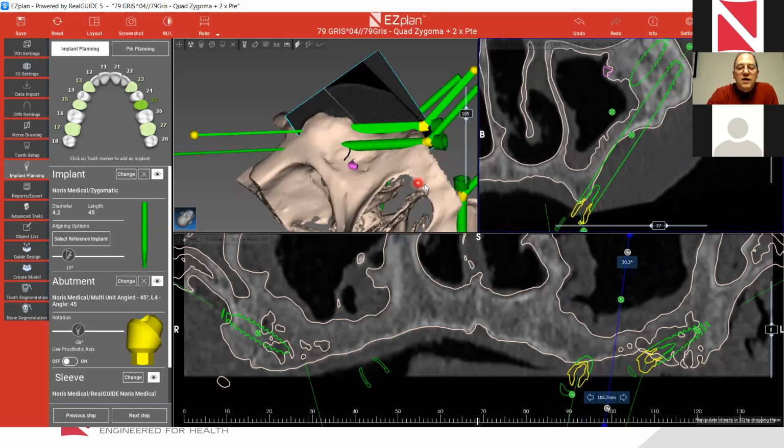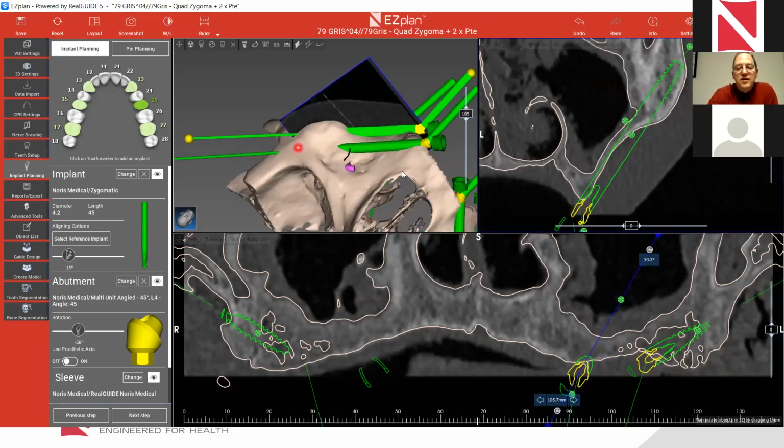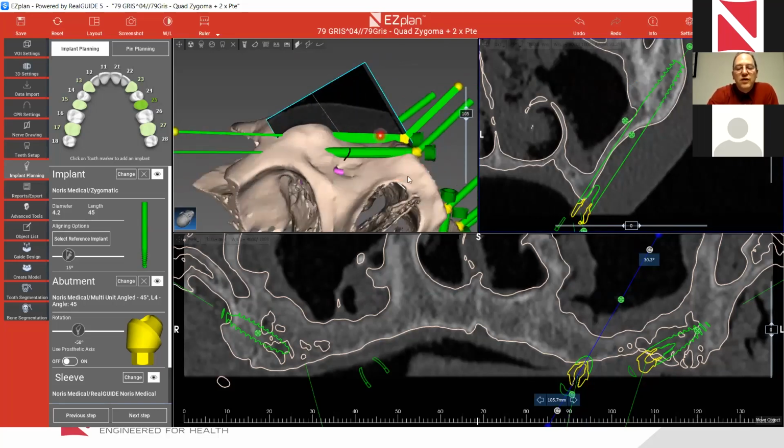So I can find the way to do that. Of course, we see this now with an implant, but we do the entry point with a diamond. I will show you later on how we do it with a diamond. We actually have an anterior implant position, and now we need to understand with our diamond how to groove. So I'll show how it's done.